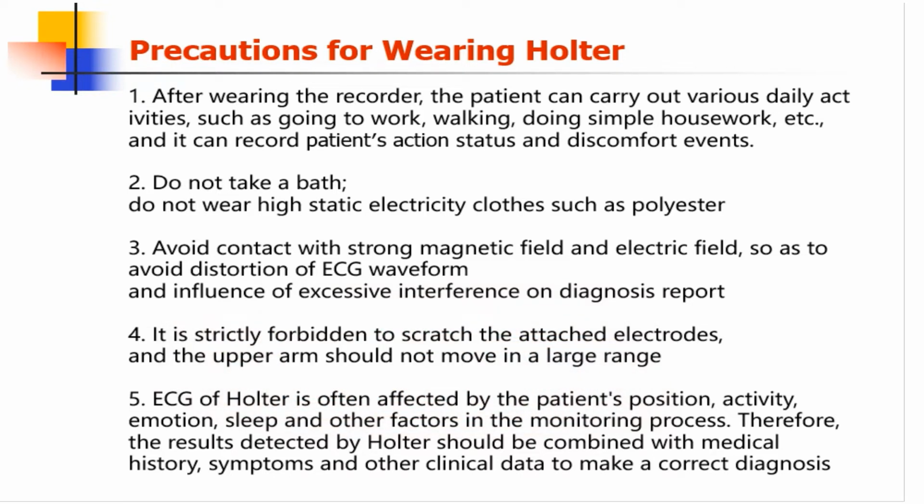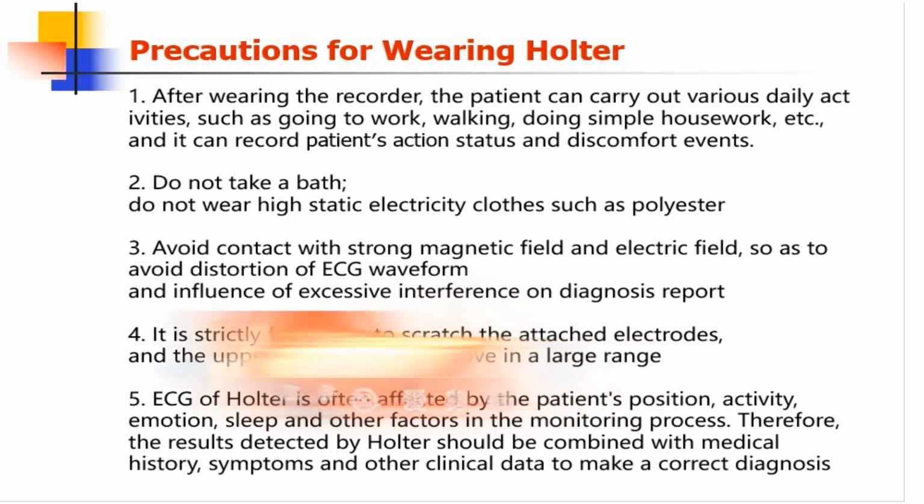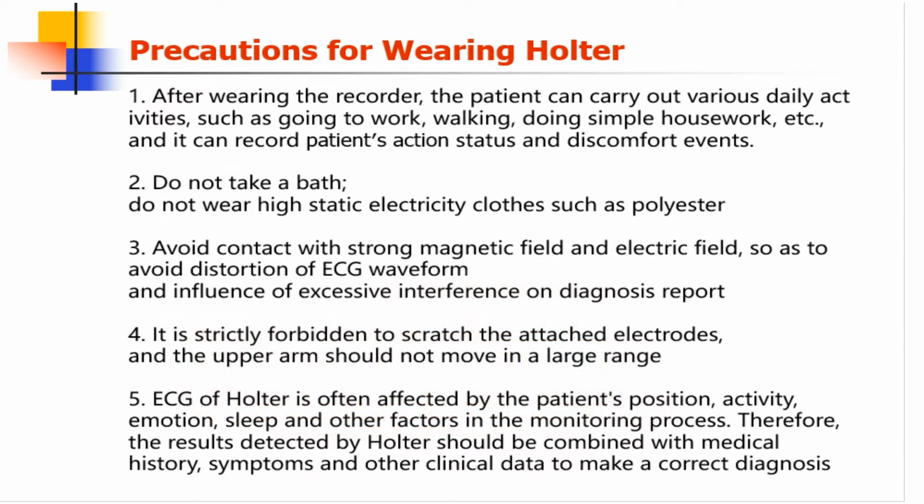Avoid contact with strong magnetic fields and electrical fields, so as to avoid distortion of the ECG waveform and the influence of excessive interference on the diagnosis report. It is strictly forbidden to scratch the attached electrodes, and the upper arm should not move in a large range.